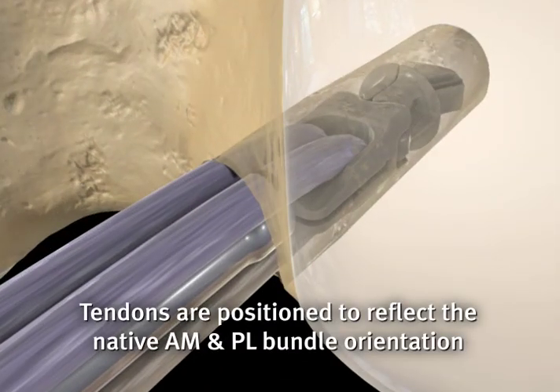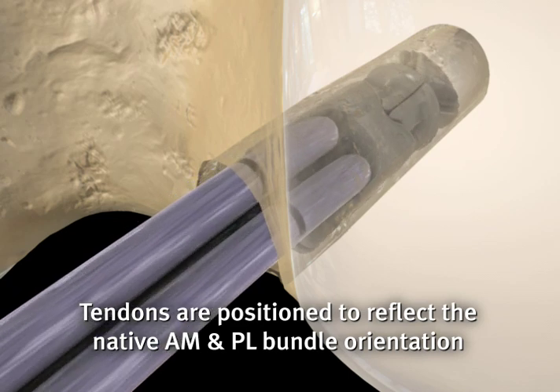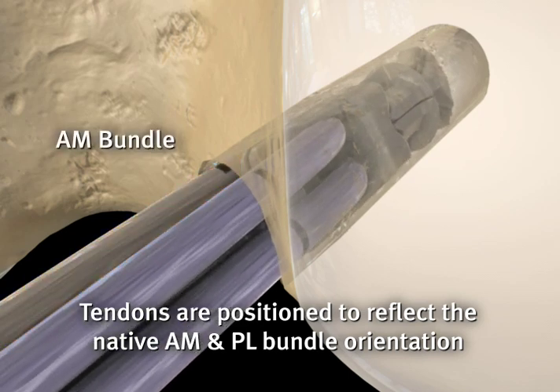The implant is then rotated clockwise so that the marked grafts, representing the AM bundle, are placed in the postero-superior position, and the unmarked grafts, representing the PL bundle, are placed in the antero-inferior position.